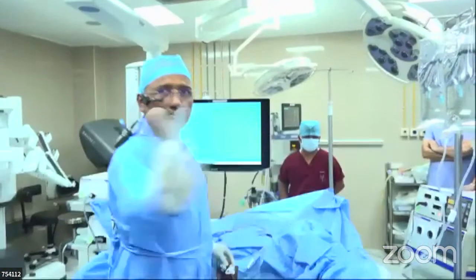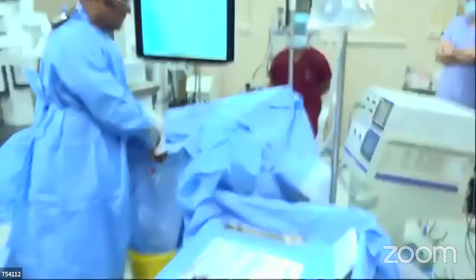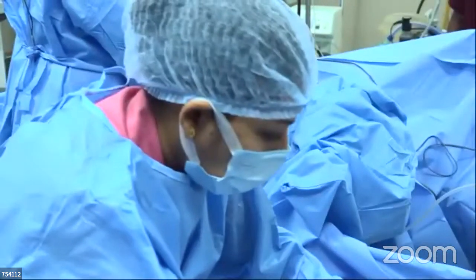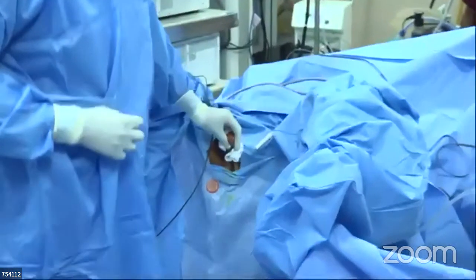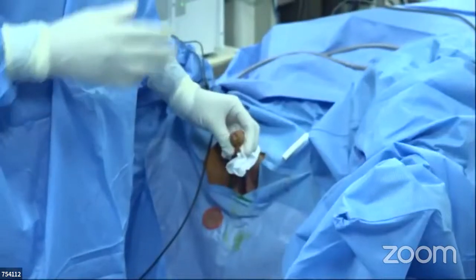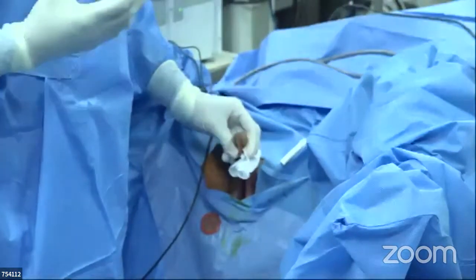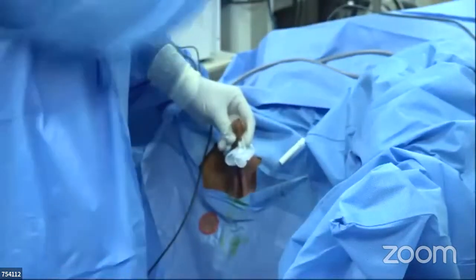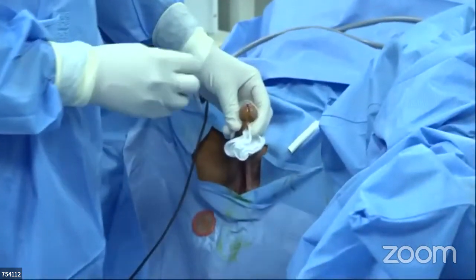But don't you think that the continuous flow will give you a better vision, and your resection will be much faster because you'll have to empty in the intermittent? No. What you said technically, scientifically, is true. But why I don't use it is only because of saving the urethra. We all accept that Indian urethras are not as wide. Sometimes you get a beautiful, nice wide urethra, but sometimes you will not. So that's the reason why I would prefer a smaller resectoscope.